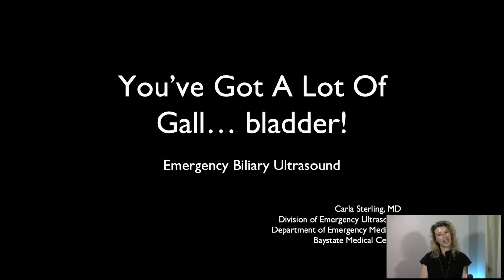We got a kitschier title for this year, but I will be talking about point of care biliary ultrasound. This was made by Adam Kellogg, who I'm sure you've been introduced to.